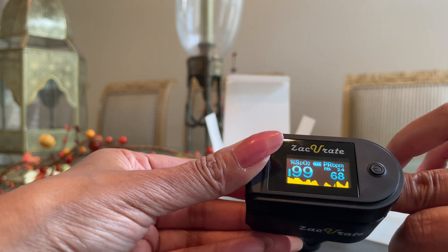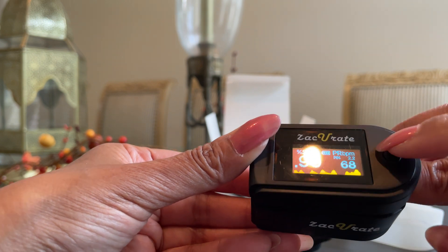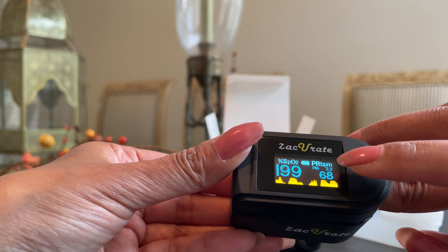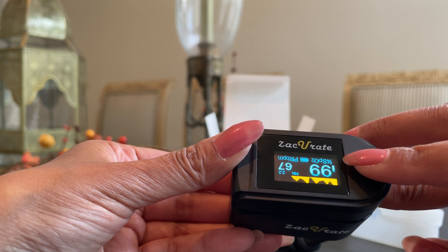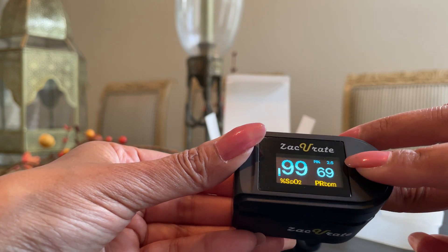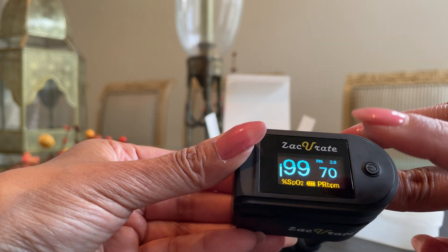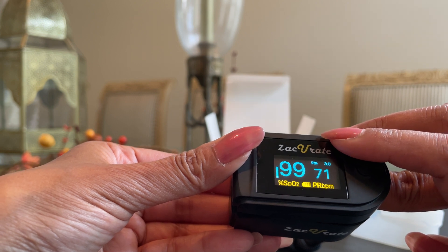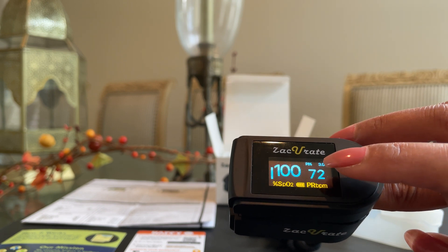A bonus feature of this newer model is that it has multiple display orientations. If I press the central button, my results change direction — now it's upside down, now it's sideways. Depending on your preference, you just click the button and it has six different display orientations to read your results, which is a cool feature entirely based on your preference.